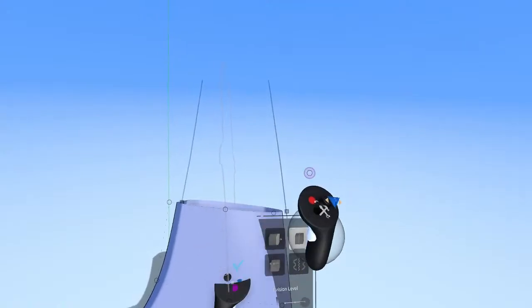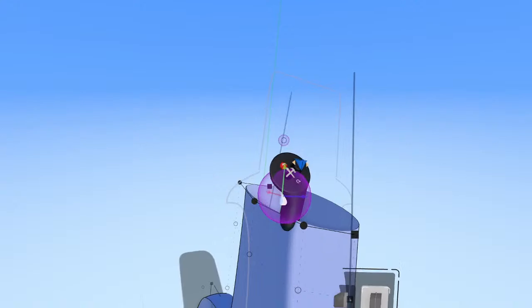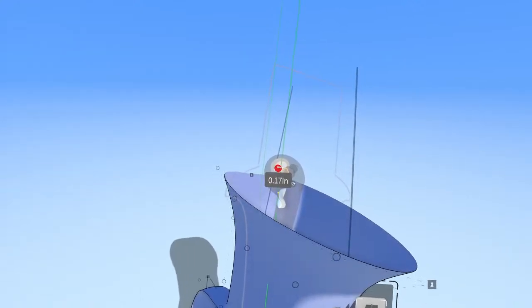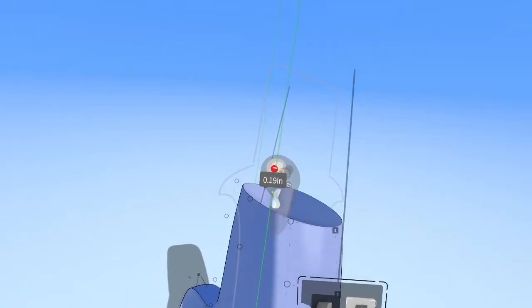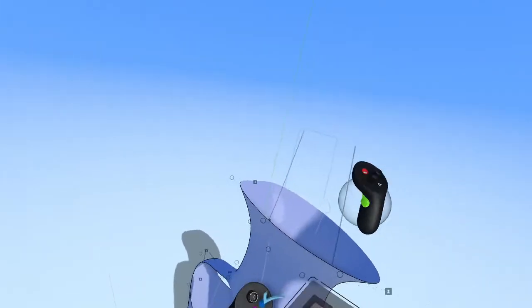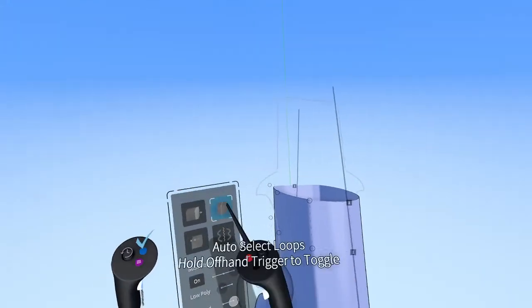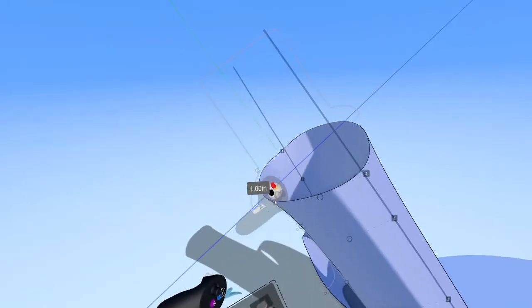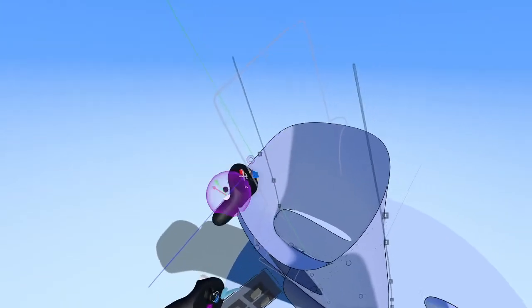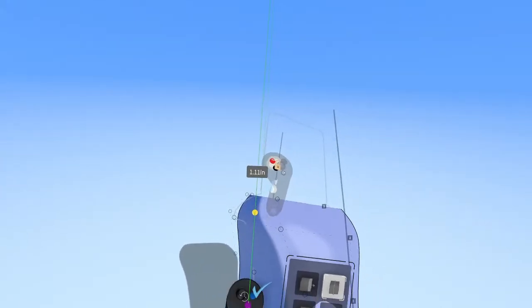All right, so for this shape here, I'm going to turn on auto edge loops and duplicate this up. And then once I've duplicated it up, grab it again and go left and right on my joystick and see if scaling is going to help me out here. So because it's an oval, it's scaling more out this way in these directions than it is out in Z. And so it's not going to work for me there. So I'm going to turn that off and just grab the individual edge loop and shift that out like this. Then turn auto edge loops on again, scale it in.